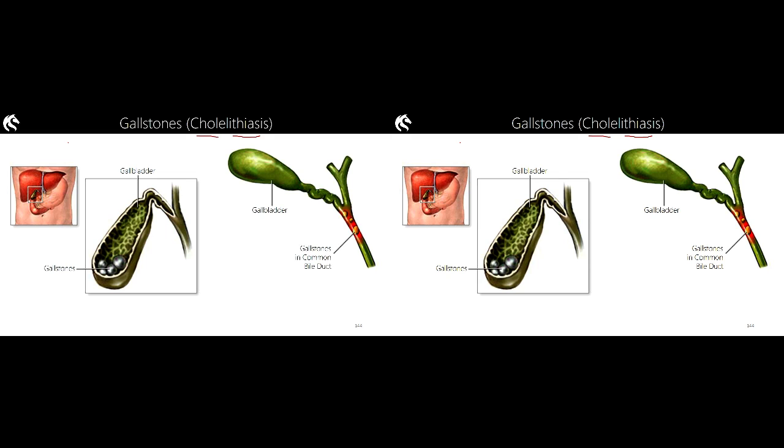She came in for back pain, and because I didn't know how to center particularly well, I included her gallbladder on the x-ray, and I found, I think, 16 gallstones. And that's fine, because if gallstones remain in the gallbladder, they're harmless. They just sit there as a useless rock taking up space. It's when they travel out and block adjacent ducts that things start to become a problem. Okay?